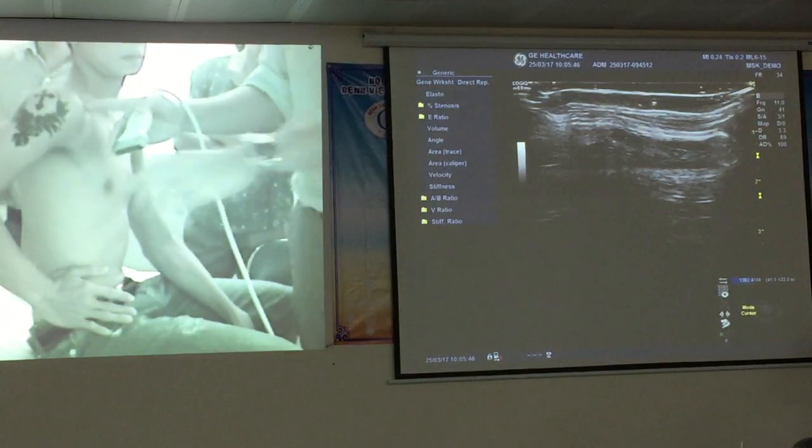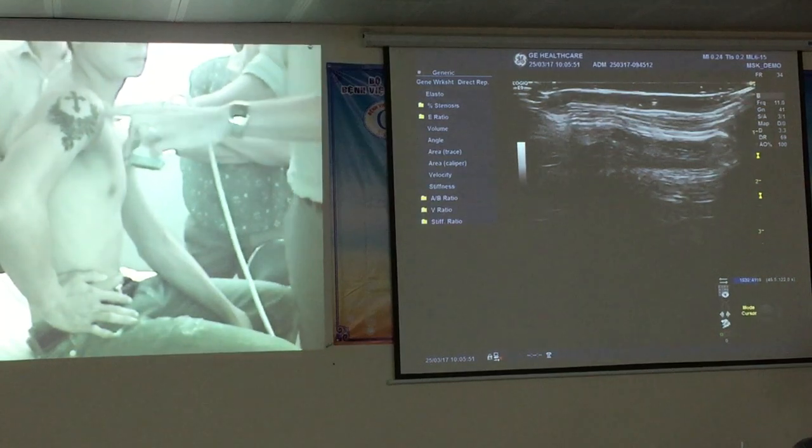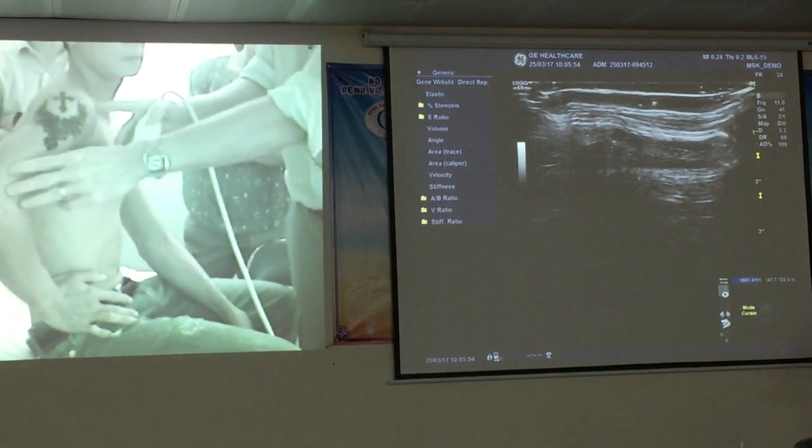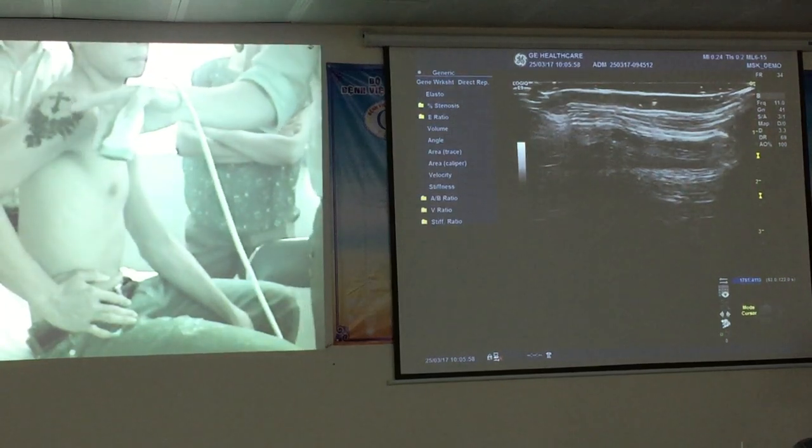And what that does, when the patient's elbow is out like a chicken wing, the tendon is quite short, but when you push the elbow back, that is pulling the tendon out and around so we can see more of it.